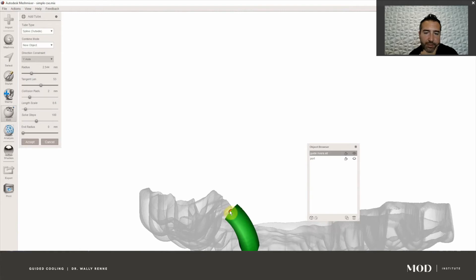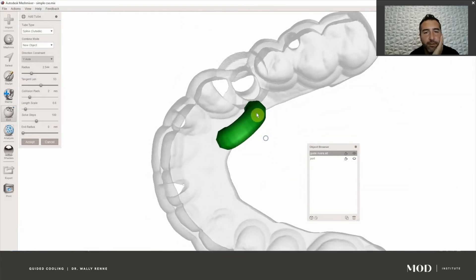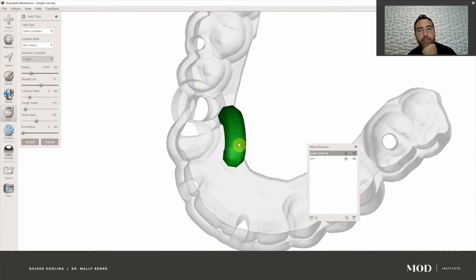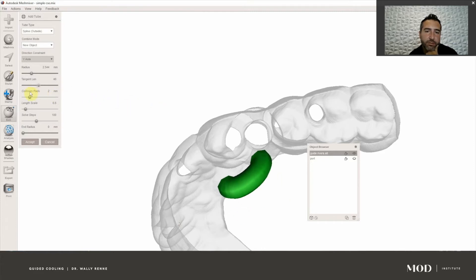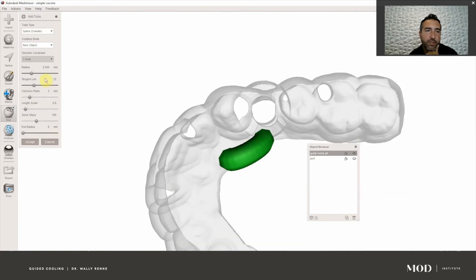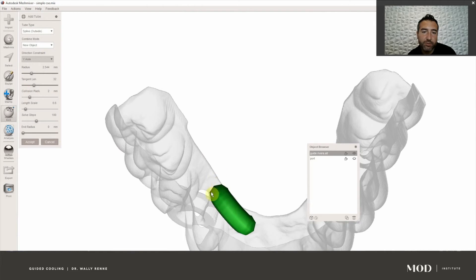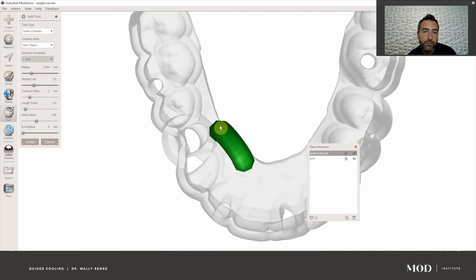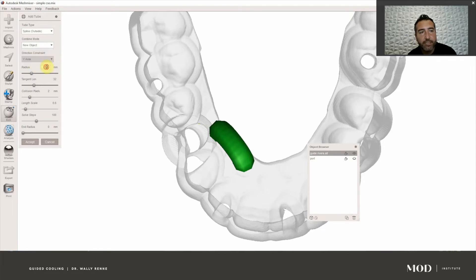We want it coming out below our sleeve housing — you've got to click right on that red ball. The issue is it's a little tall, and the way you change the arc of this curve is this tangent line. You can make it really tall like a rainbow or bring it down. I'm going to bring it down just a little bit and hit X. That's a good spot — we have a start point which doesn't matter where it starts, but the end point is right apical to the sleeve housing on the guide. Now we have the combine mode — we can do boolean, append, or new object.